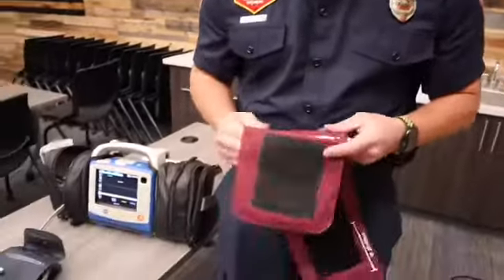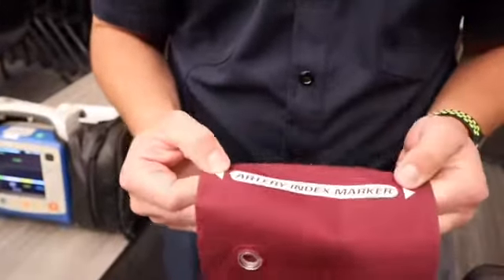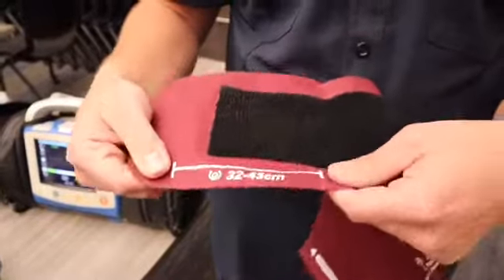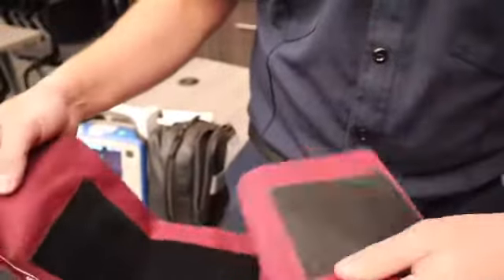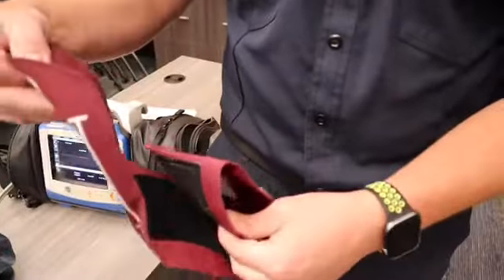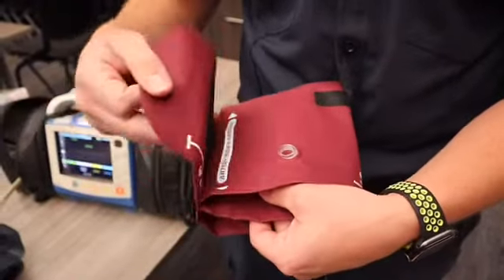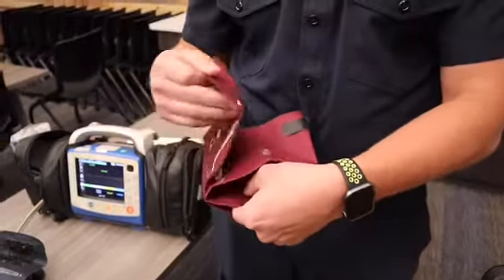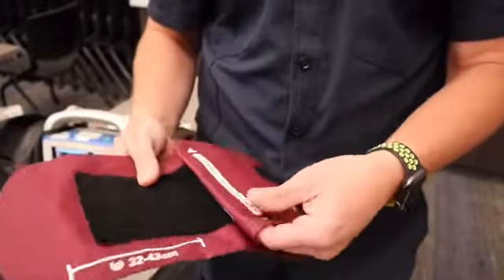If you notice here, it says artery index marker — these arrows are your reference point. On the outside and the inside of the cuff, you have this line. When you are placing this on the arm, these arrows need to fall within those lines. That's how you know you have a properly sized cuff. If you are outside of those lines, you need to go up or down depending on where it falls.